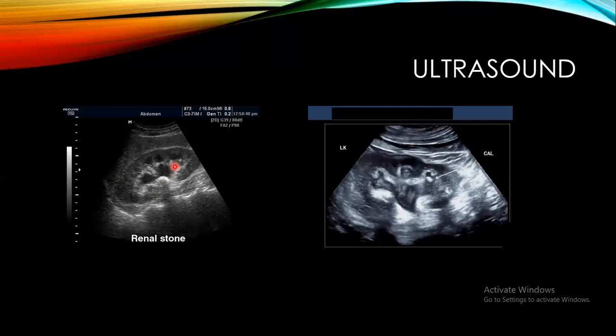بها بسهولة، وراها الرحم راح يبين بشكل واضح جدا، لأن راح يبين ارتداد الرحم، راح تبين الباثولوجي الموجودة بالرحم فقط إذا كانت المثانة ممتلئة. أما إذا كانت ما ممتلئة أو partially filled راح تضيع هواية باثولوجي أو راح يضيع الكاونتر أوف ذا يوترس. وهذا هو الأساس اللي دائما نقول للمريضة من تفحصين لازم تكون مثانتش محصورة أو ممتلئة إدرار. ننتقل على هاي الصورة.